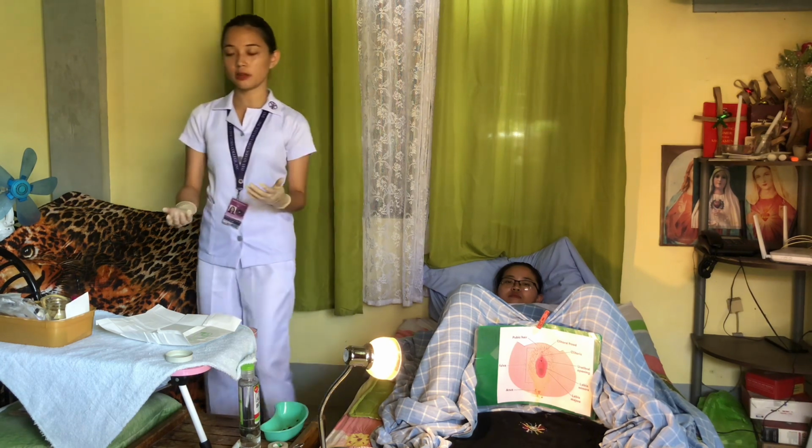Okay, so after donning my gloves, I am going to get my eye sheet and place it on my patient.